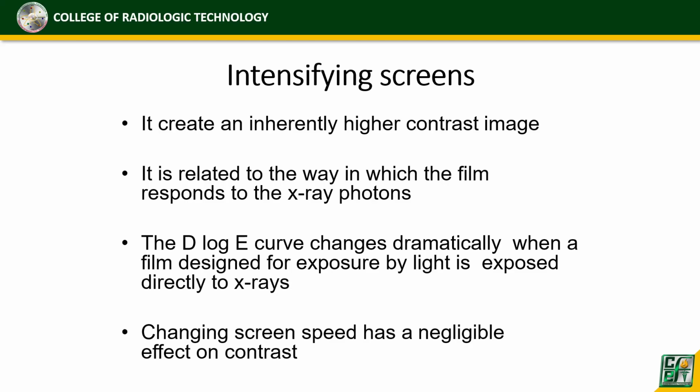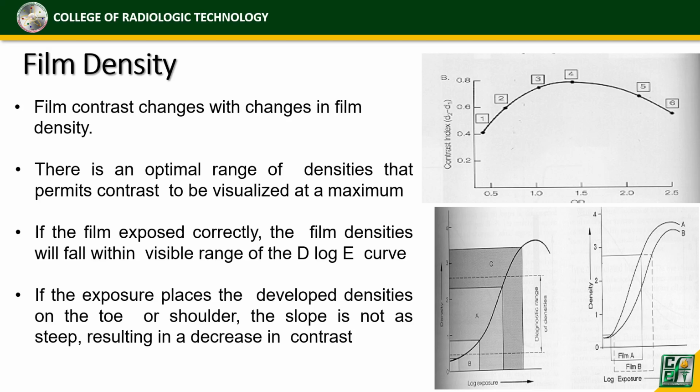So, yung D-log E curve, later discuss natin yan. Then, changing screen speed has a negligible effect on contrast. So, okay, kahit na siya ay may effect or factor yung intensifying screen, okay, negligible lang yung kanyang epekto. Okay? Hindi siya major na nakaka-effect sa contrast sa ating image. Okay? Yung intensifying screen.